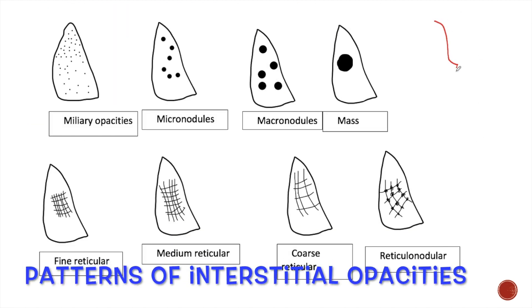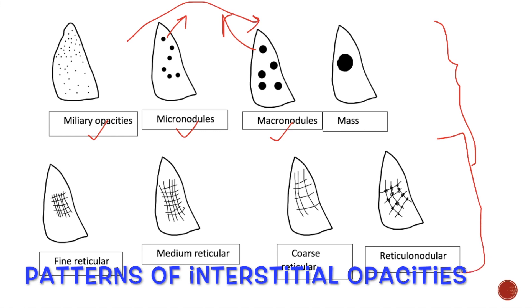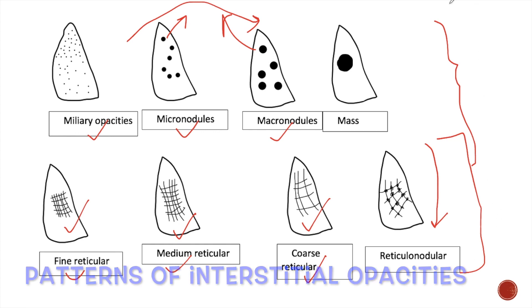Now look at the different patterns of interstitial opacities. These opacities may occur in the form of nodules, which are rounded opacities or dots of various sizes, named according to size — miliary opacities, micronodules, and macronodules. The next form of interstitial opacities are reticulae, which are net-like opacities. They are also of various sizes: fine reticular, medium reticular, and coarse reticular types. When nodules and reticulae are seen together, these are known as reticulonodular opacities.